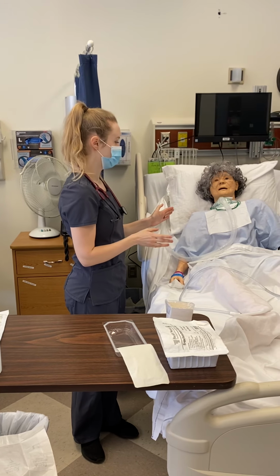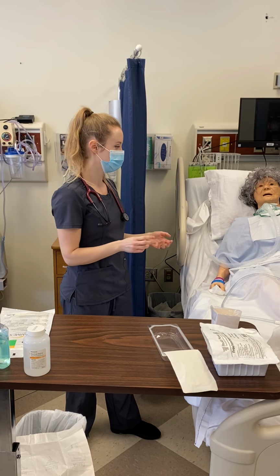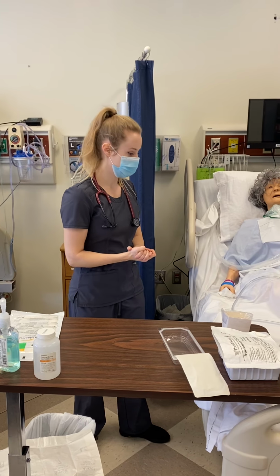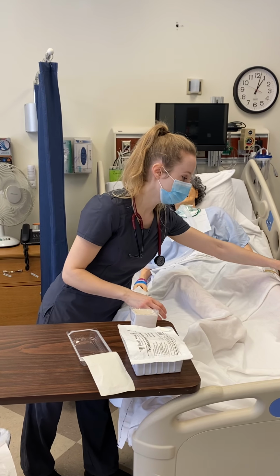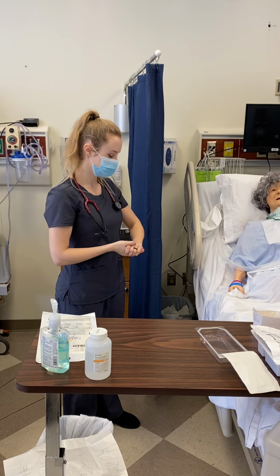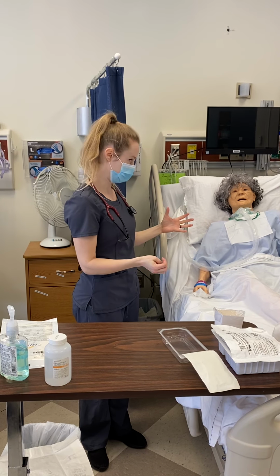I've checked on my patient. Are they having distress? I'm also documenting how they responded to the treatment, the amount, color, and consistency of the secretions I suctioned, and the number of passes that it took. I will turn my suctioning off, and I will return the oxygen to the pre-hyperoxygenation level, whatever the provider had ordered for long-term care.